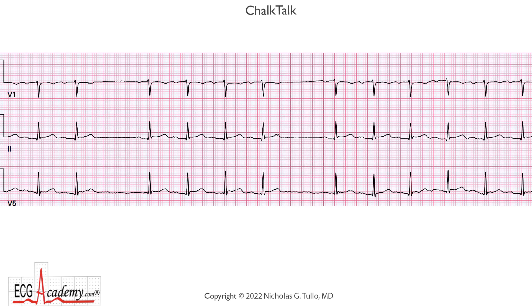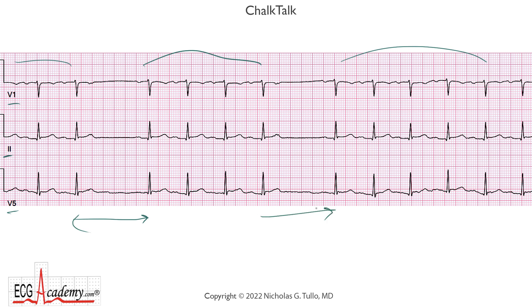Hi, it's Dr. Nick with the ECG Academy, and this week's Chalk Talk is an interesting rhythm strip from a 12-lead. As you can see on the left-hand side, we have three simultaneous leads. As you look at the tracing, you can see there almost appears to be group beating — there's a group of four, and then another group here. But these very prominent pauses are present, and we have to figure out what's causing the pause.